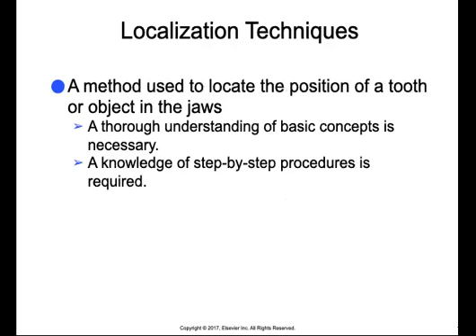So localization technique is a method used to locate the position of a tooth or an object in the jaws. Before the dental radiographer can use localization techniques, a thorough understanding of basic concepts is necessary. In addition, knowledge of the step-by-step procedures is required.